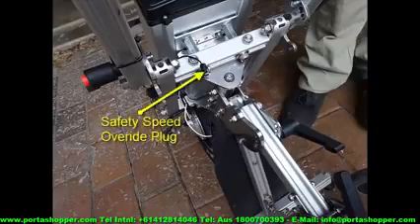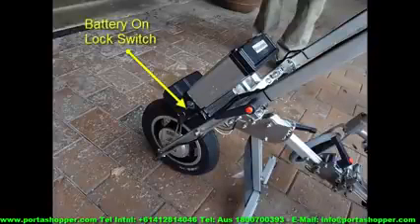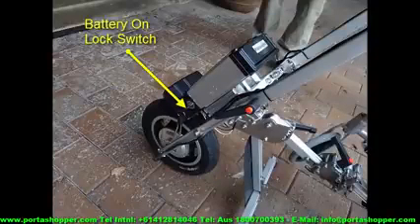Here you can see the little black plug, which is the European Safety Standard speed governor, and this should only be unplugged once you are completely comfortable with taking the responsibility of engaging turbo speed, which would literally double the speed of your unit. This arrow points towards the battery lock, and remember your unit will not operate without this key being switched to the on position.